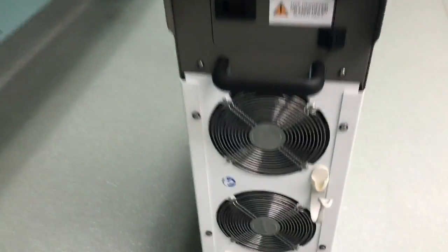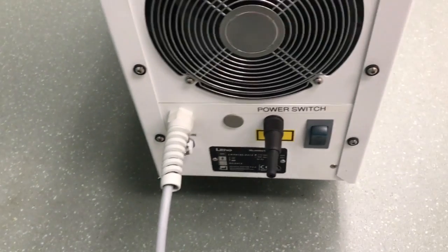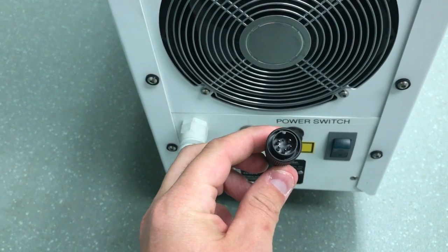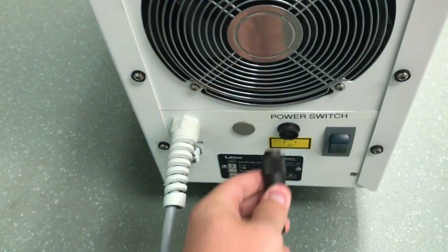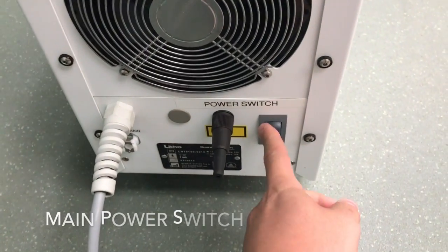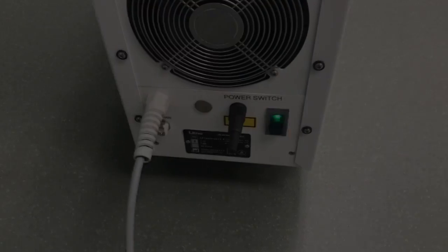On the back of the laser we have the power cord and the interlock connector, which needs to be on. It has a piece at six o'clock that allows it to connect. The power switch is right here and should always be on — feel free to keep that on.